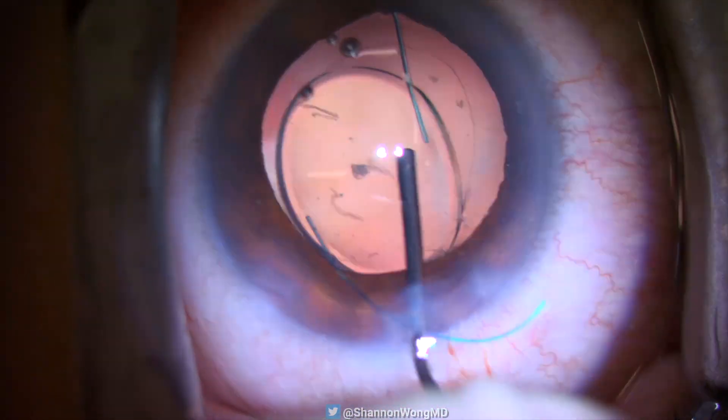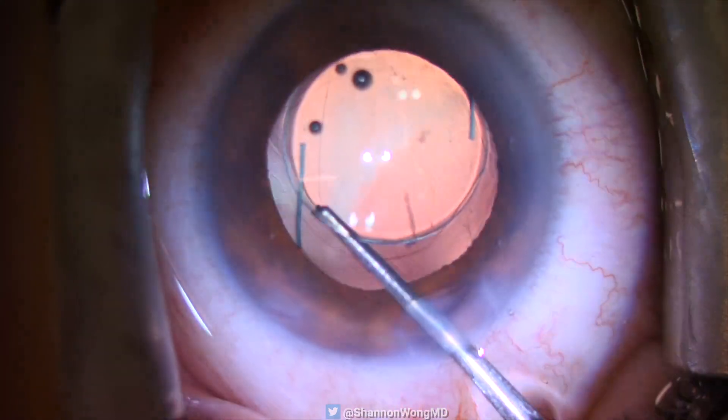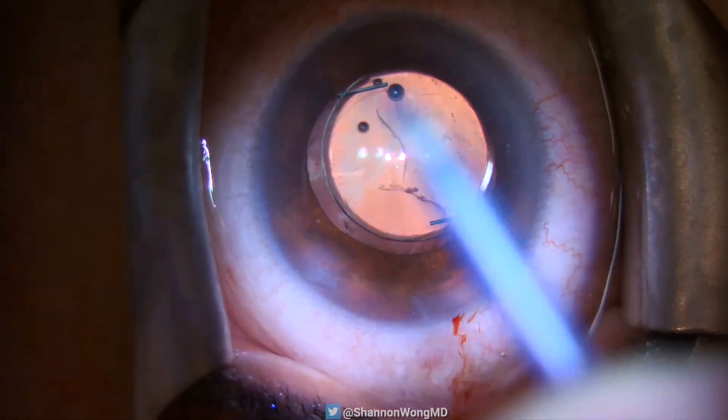Once the haptic shape is normalized, we place the IOL and haptics back into the capsular bag. During irrigation and aspiration, we confirm that the IOL is well-centered.